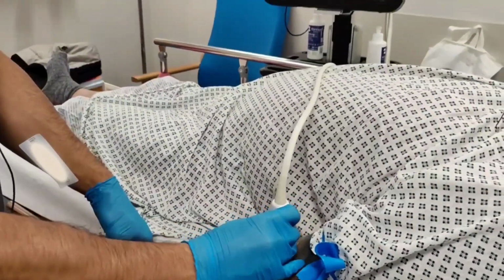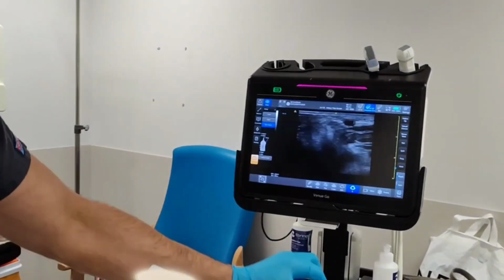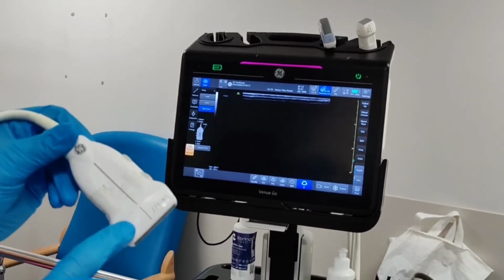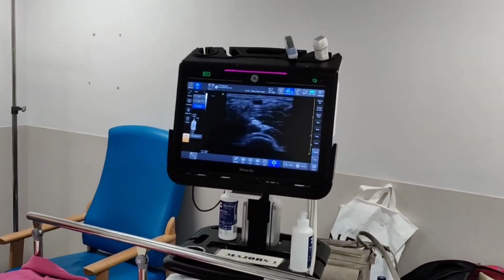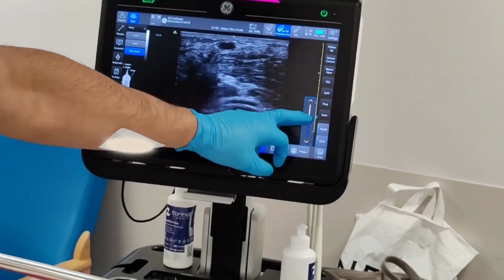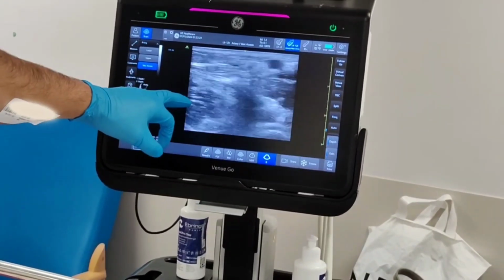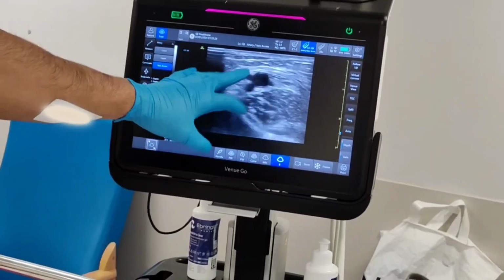We've got some vasculature in here. Now zoom in on this if you will please. So what I'm just going to point out is firstly there's a yellow arrow here. That reflects the middle of my probe over here. Not all probes have this, but it's a great little marker. Okay. Now you can see, if I just change the gain on this to make it a little bit brighter, you can see that little circle there. Yeah. If I go elsewhere as well, you'll see other circles here. These are all blood vessels.